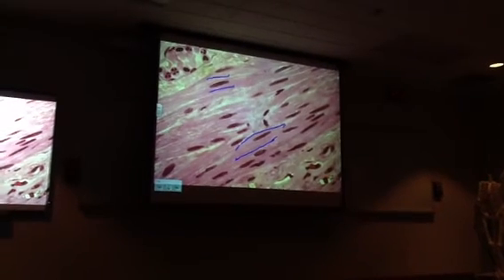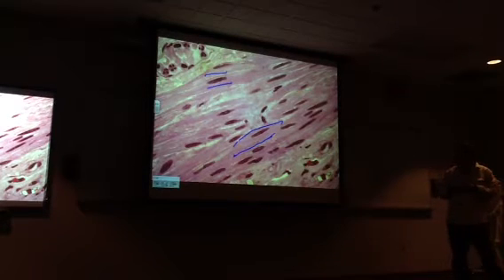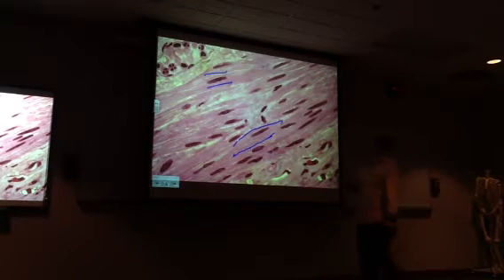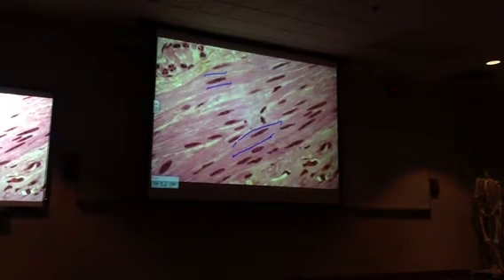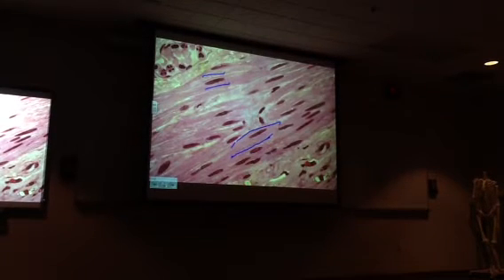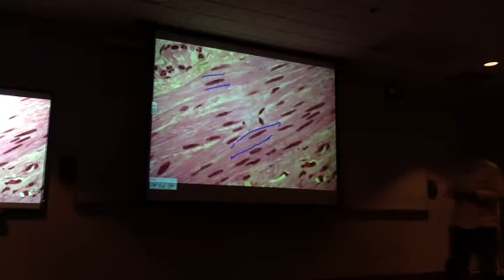The other thing, which is kind of a finer point to suggest it's smooth muscle, but it makes a lot of sense from the metabolic activity, is to look at the nuclei. They have a punctate or a granular appearance, which is seeing maybe little nucleoli, or just clumps of heterochromatin and euchromatin, implying a metabolically active cell. And smooth muscle is very active metabolically, very active synthetically. So I use that sometimes as a hint if I'm not absolutely sure that it's smooth muscle.